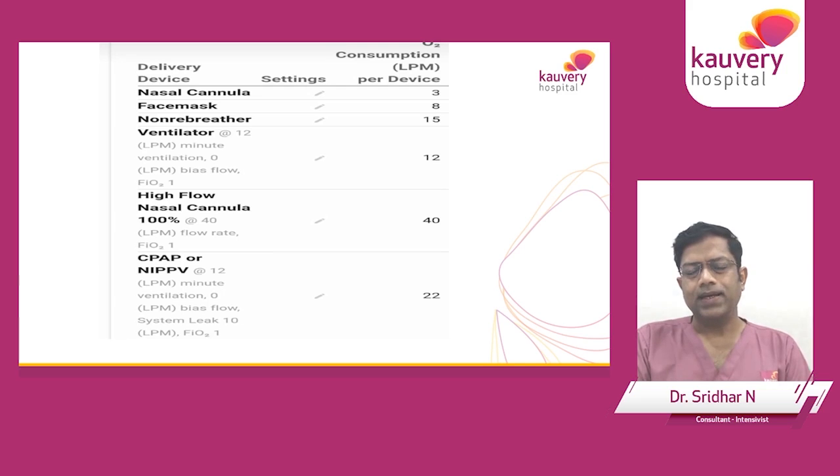So if you look at it, the high flow nasal cannula giving 40 liters per minute of 100% oxygen still consumes 2 to 3 times what an invasive ventilator or a CPAP would consume. So in other words, when we are in an oxygen conserving mode, when our oxygen supplies are always precarious, then there is almost no role for using the high flow nasal cannula. When I say no role, I do not mean clinically. Clinically, I still think they're great devices. I think we have to stop using them purely on grounds of conserving the oxygen that we have.